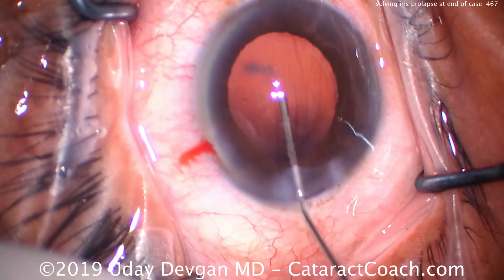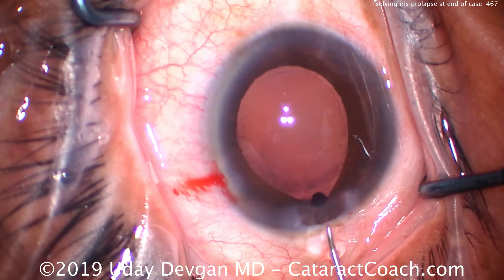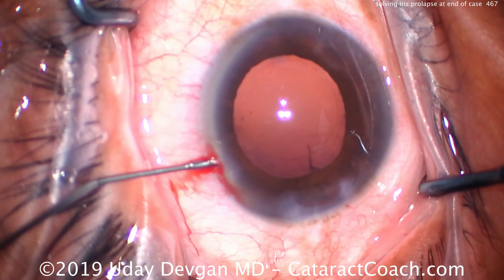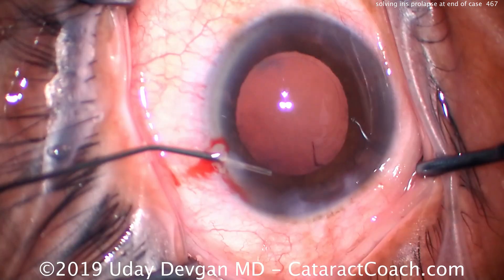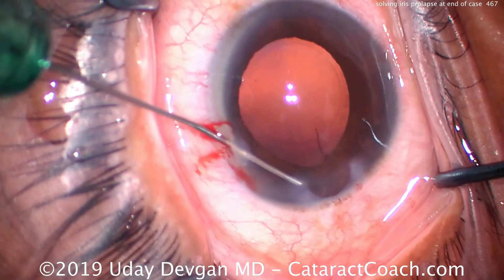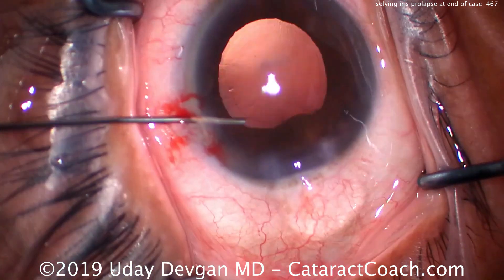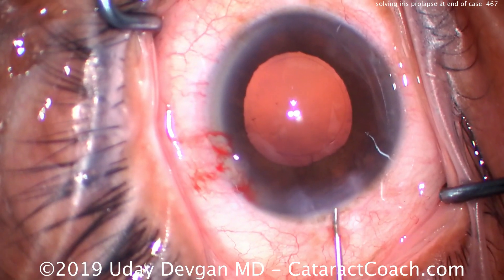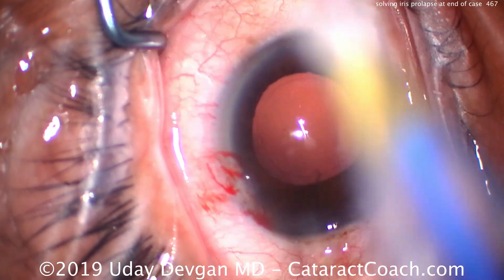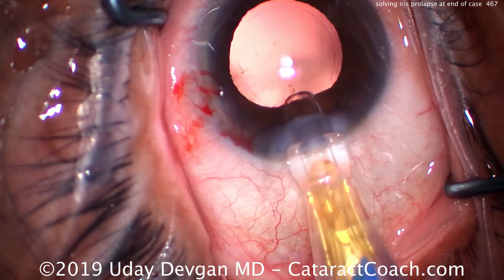Push it back in the eye. I flatten the AC, then fill it up with viscoelastic — and when we fill it with viscoelastic, we have more prolapse. This iris is a little floppy. We push it back in the eye, and now we're going to put another aliquot — a big plug of viscoelastic on top of that, or sweep it back in via the paracentesis. Let's put a big wad of viscoelastic on top of that to prevent it from coming in the way of the IOL injector tip.